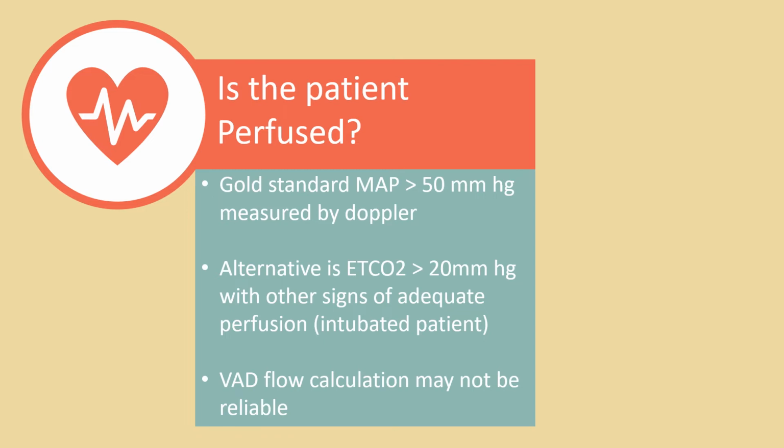If it's above 50, the patient is perfused. If it's less than 50, they're not perfused. So you consider that just like you don't have a pulse.